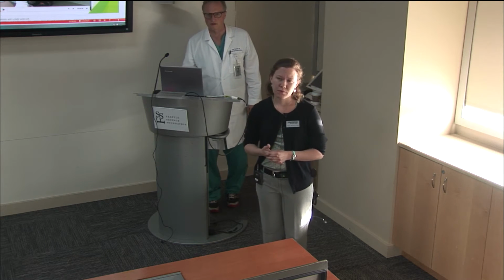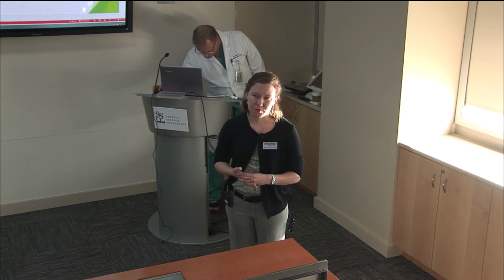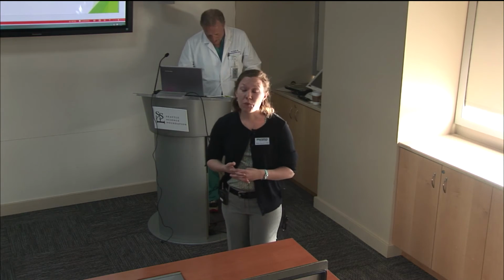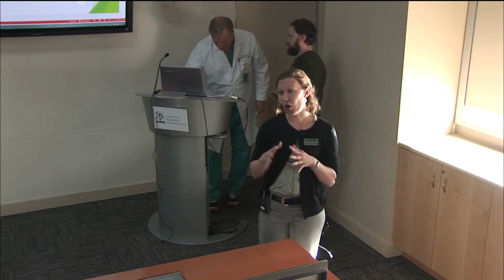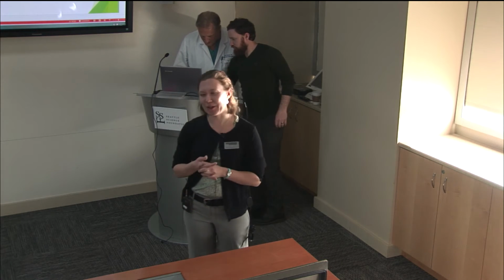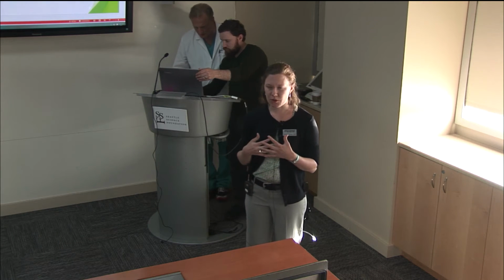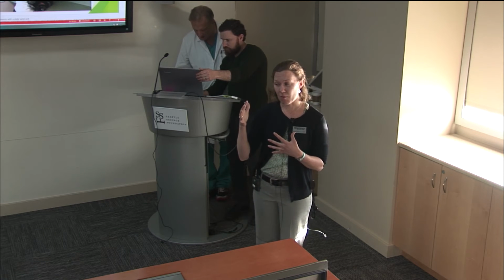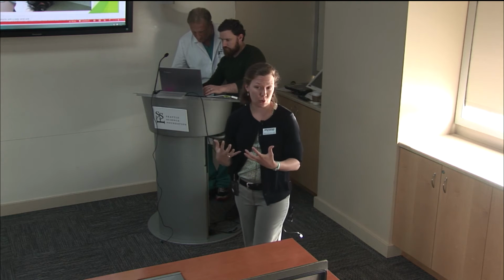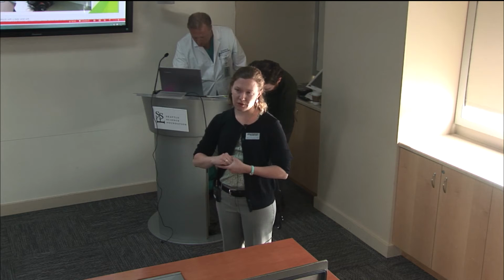And you had mentioned spasticity as being one of the things you have to look at. What is your experience in terms of modified Ashworth score limitation, 1+ or 2, or we're certainly looking not at 3? Less than 3 is really our target goal, but there is some wiggle room in there. But for the right patient, even if their Ashworth scale is a little higher, if they really understand that they're going to have to put in extra work to control their tone before this becomes functional, then they may be an appropriate patient as well.